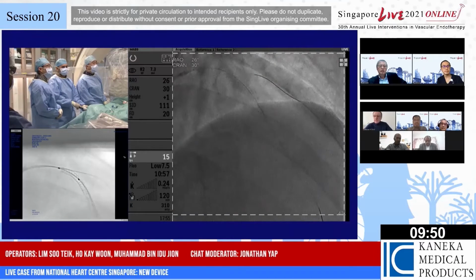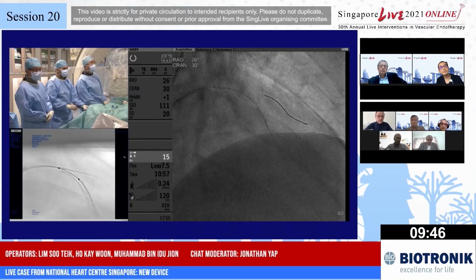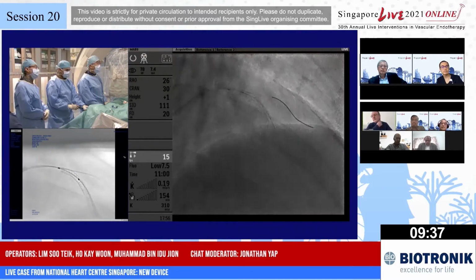Sorry, Dr. Colombo, you mentioned doing the OCT first? No, I think I will do routine post-dilatation, maybe not super aggressive, but in the interest of time, do a post-dilatation and then do OCT.